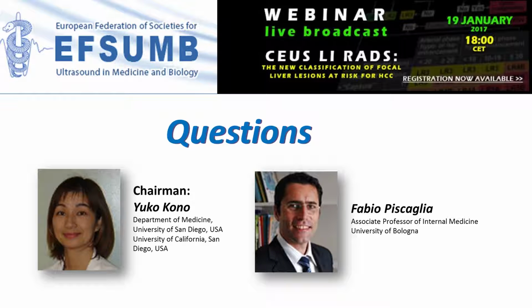And I think regarding the expertise, it is not difficult to interpret the image. It's difficult to get good images. So first of all, you have to become very good in assessing cirrhotic livers. But once you are able to recognize a nodule, to keep the target in the right position when the patient is breathing, then interpreting the CEUS images becomes quite easy.